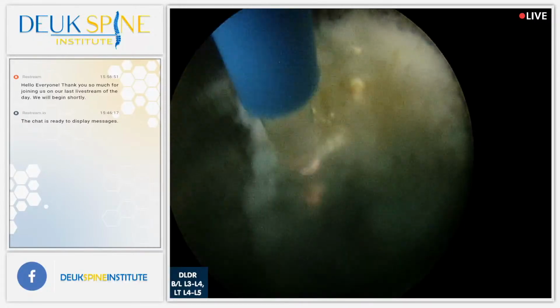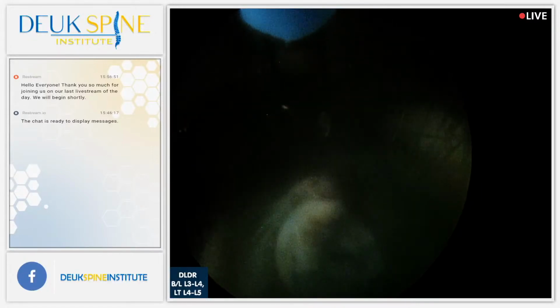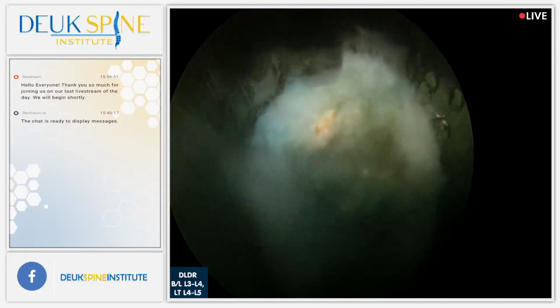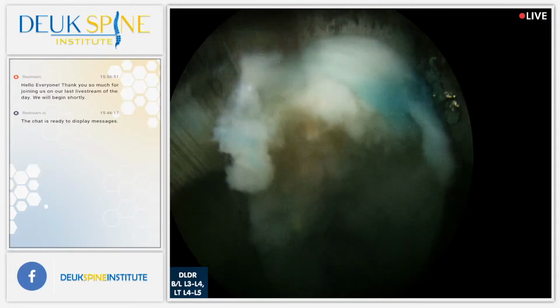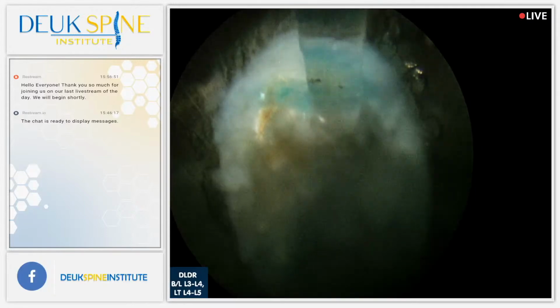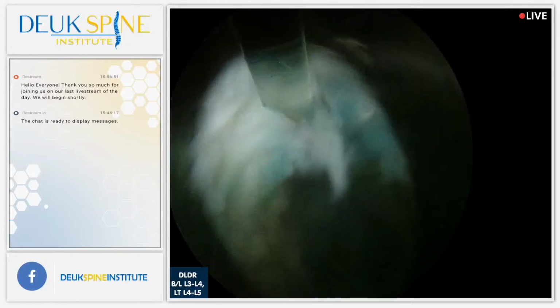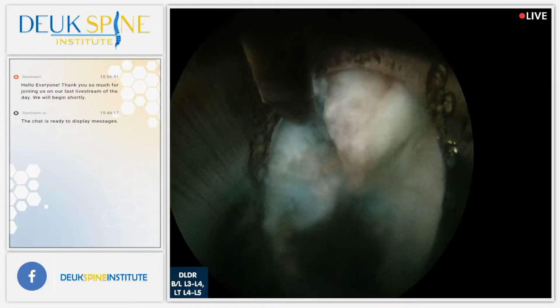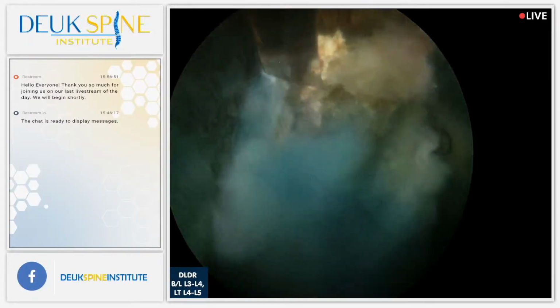For those of you who don't know what we're talking about, we've started to do a minimally invasive procedure to repair people's knees when they have knee pain from arthritis in the knee, and it's taking away the knee pain completely without putting them through a major surgery. It's done in 15 minutes. I'm excited for the hip joint. That's the future, right? Oh, look at the tear right there. You guys see the blue tear with the granulation tissue, the pink stuff on it? That's where all the pain's coming from. Look at that herniation. Here it comes.